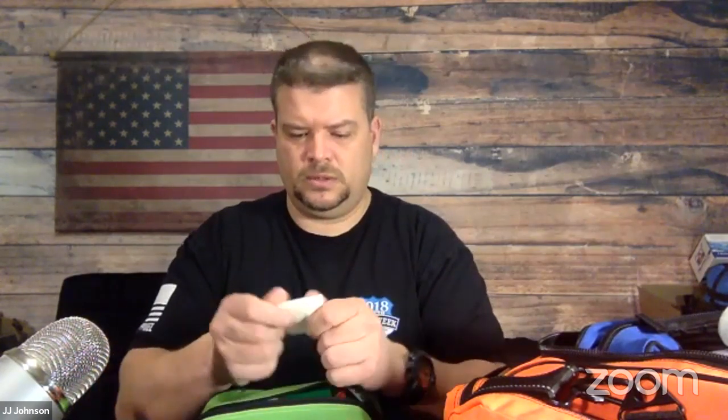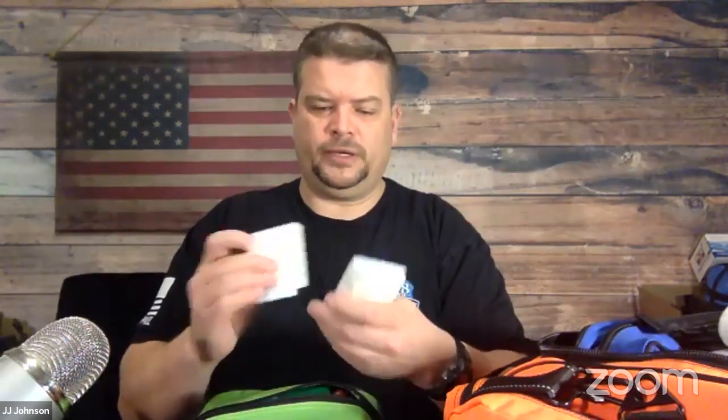Okay, there's that one. Okay, so this one was green, and that was kind of like, yeah, you know, you're okay. It's good to go. You're not going to die. The boo-boo kit, maybe, something along those lines. So let's see what we got in here. Some band-aids, some finger band-aids, the kind that go on your finger, little H-shaped and the butterfly-shaped ones. Some of those. There's all kinds of crap in here.